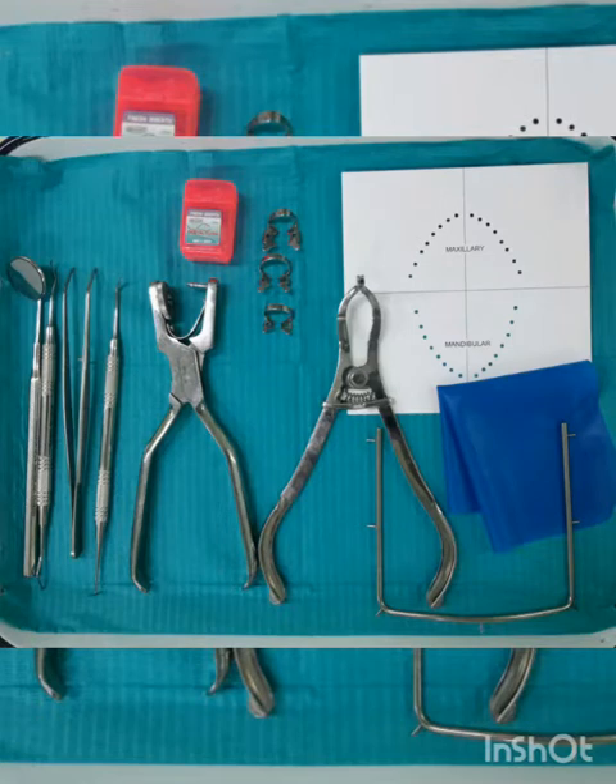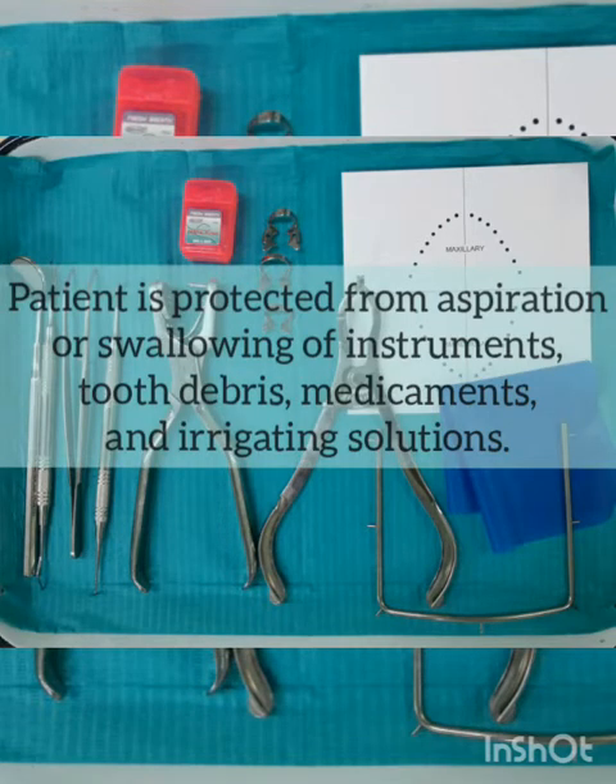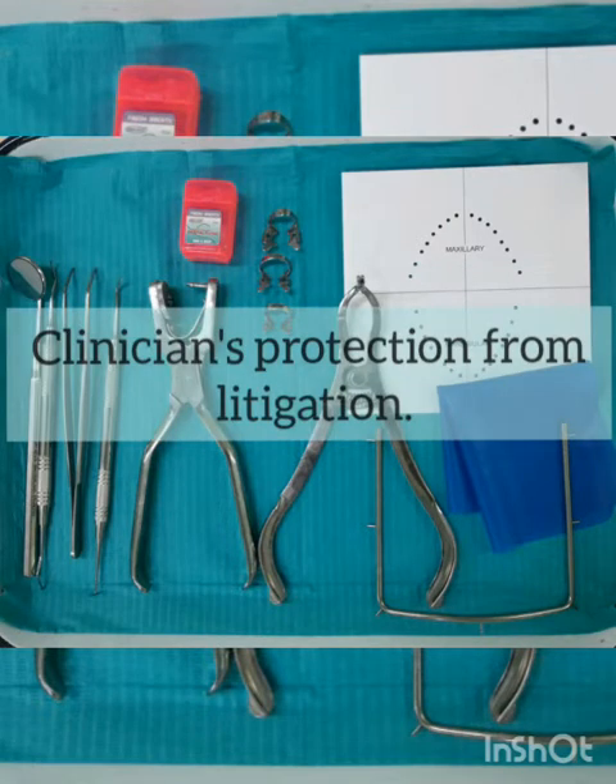Here are some of the advantages why we perform or why we isolate the tooth. The patient is protected from aspiration or from swallowing of instruments, tooth debris, medicaments, and irrigating solution. As a clinician, we are also protected from litigation because of the patient's aspiration or swallowing of an endodontic file. Routine placement of the rubber dam is considered the standard of care.